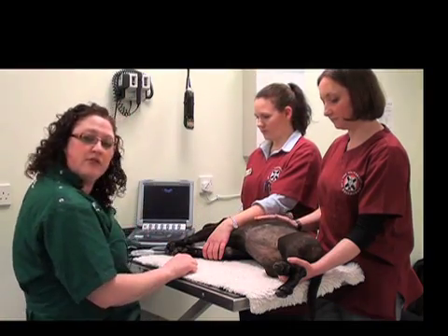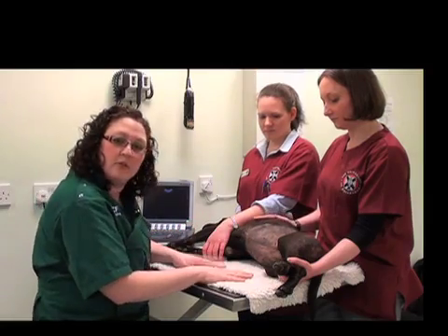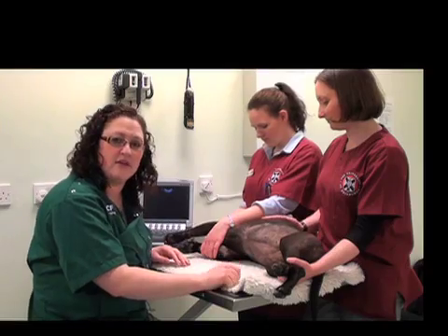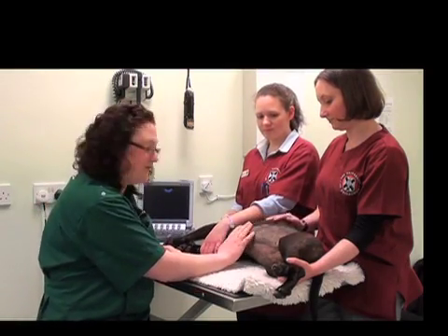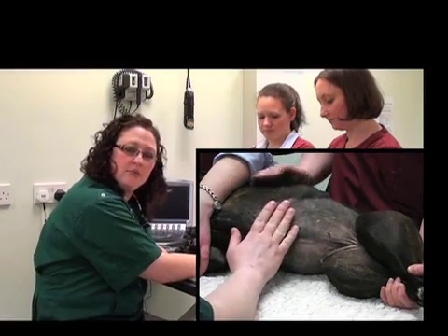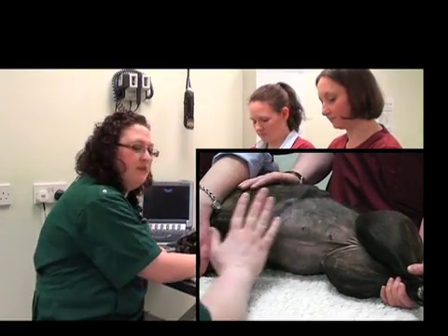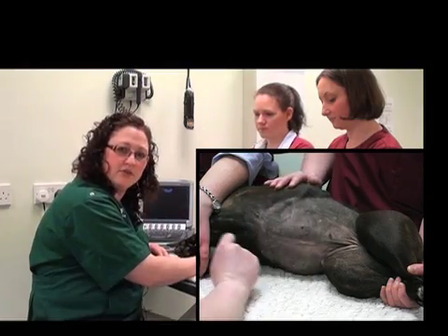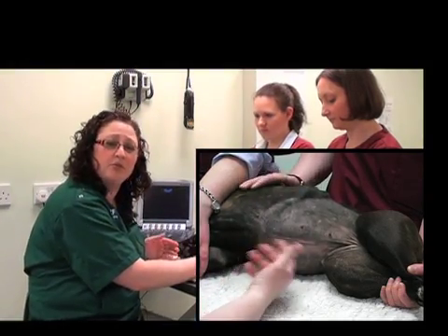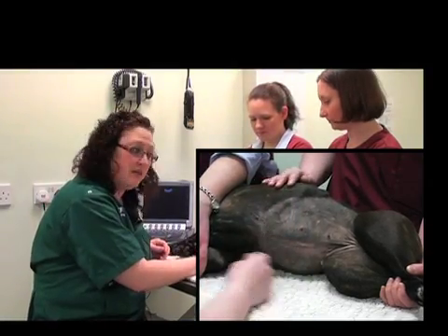Another important thing to do is to prepare your patient. This means placing the patient on a really soft surface, whether it's a vet bed such as this or a nice thick towel — it will really help her to stay comfortable. You also need to ensure that you clip a sufficient amount of hair away from the skin itself. This is because air is an enemy of ultrasound; it will really cause your image quality to be very poor if the coat is very thick or there's a lot of air trapping there.